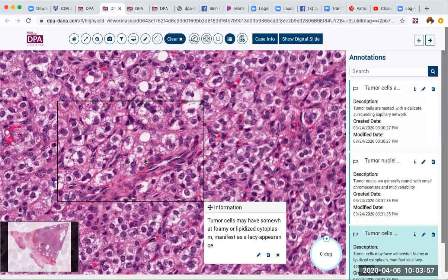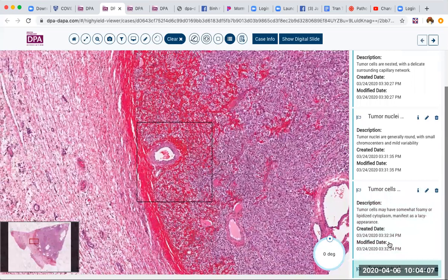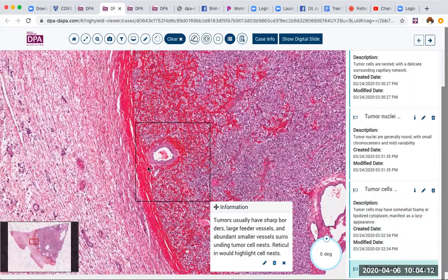The final annotation in this case: these tumors are usually highly vascular with sharp borders. A reticulin stain could be useful in this type of neoplasm to highlight this architectural feature as well. The final diagnosis in this case is a steroid cell tumor occurring in the ovary, producing some sort of hormonal stimulus. These can not infrequently be associated with endometrial manifestations of hormone secretion and even secondary sex characteristics typical of hormonal stimulation.